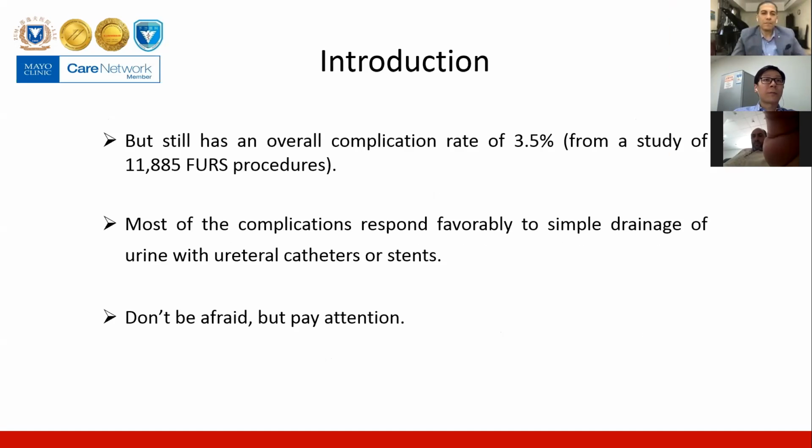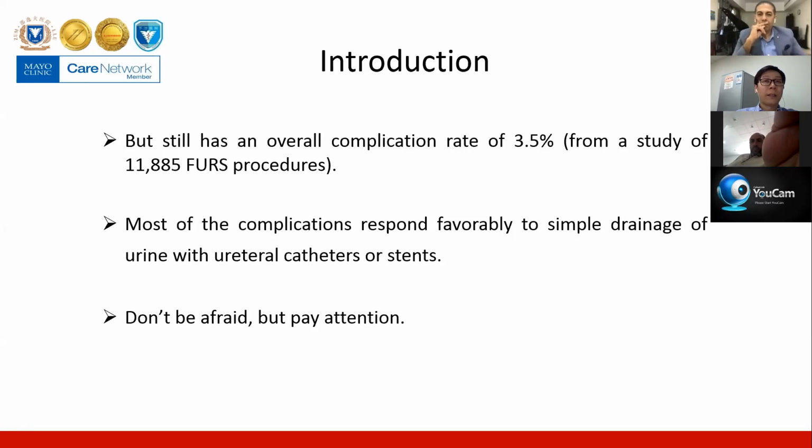11,885 FURS procedures. Fortunately, most of the complications caused by ureteral stones and their management respond favorably to simple drainage of urine with ureteral catheters or stents. But unfortunately, although they are rare, some complications can be severe, even life-threatening. So what is our attitude to flexible ureteroscopy lithotripsy? I think it should be, don't be afraid, but we should pay attention, especially to the complications.